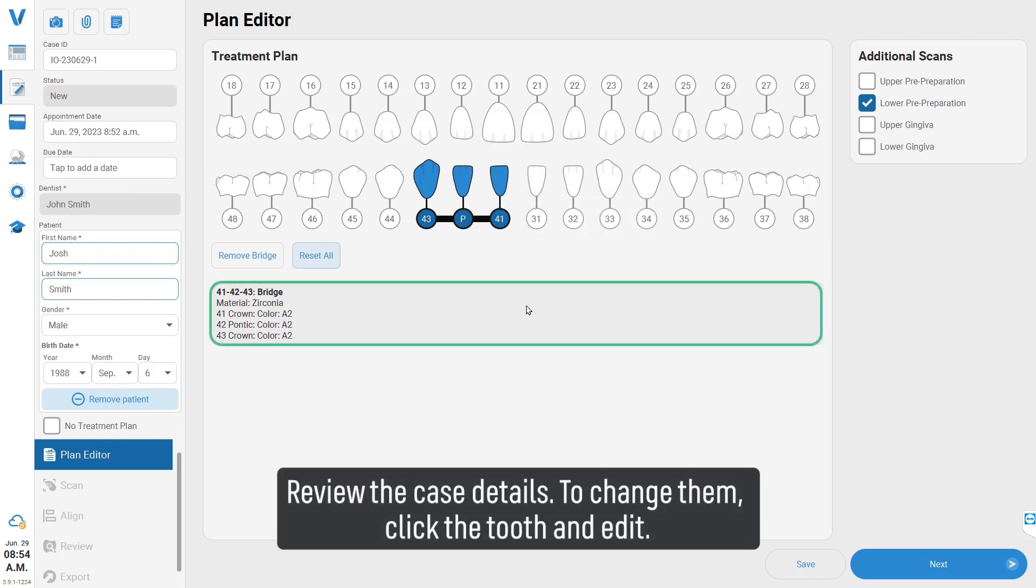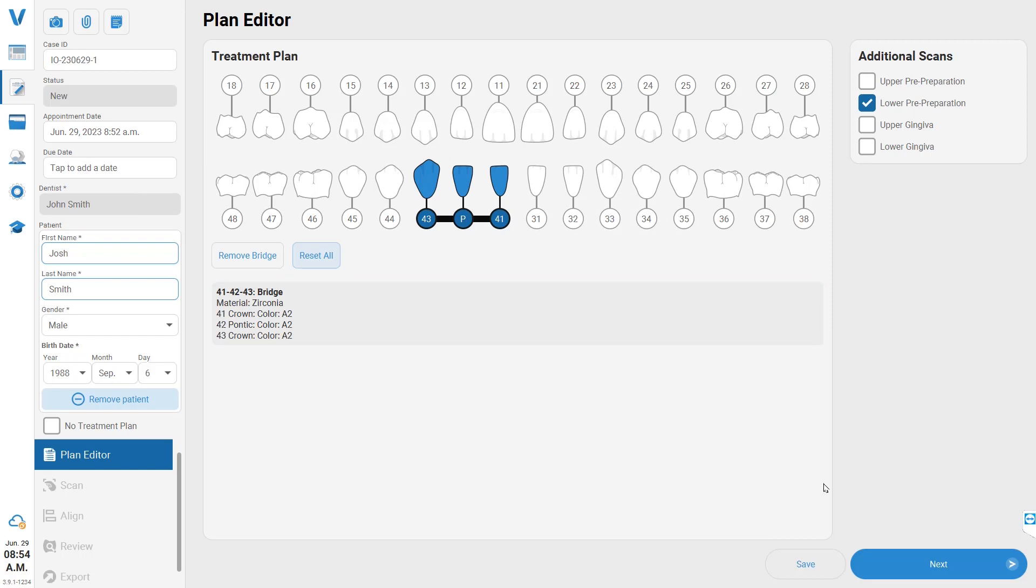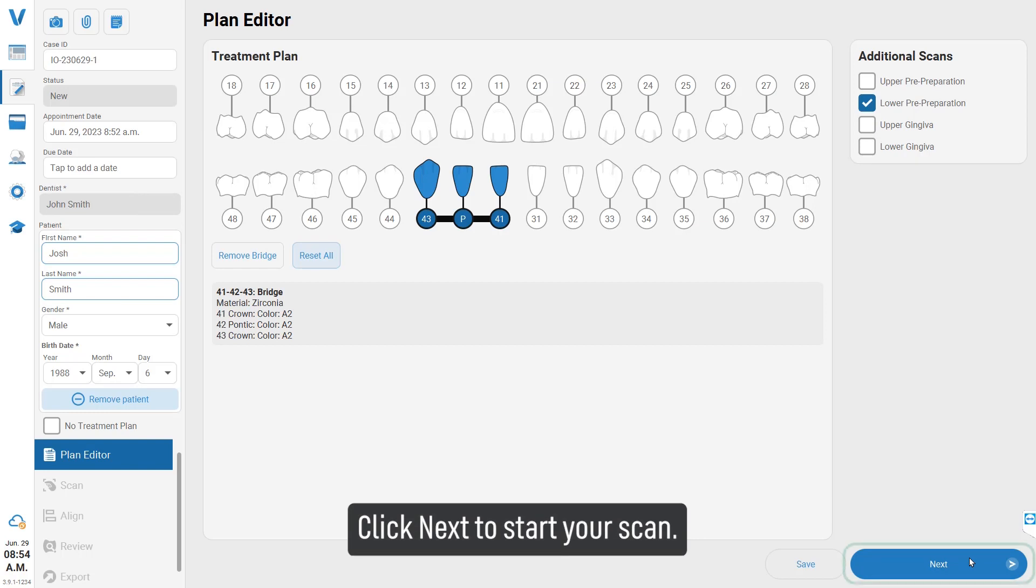To change details, click the tooth and edit. Click 'Next' to start your scan.